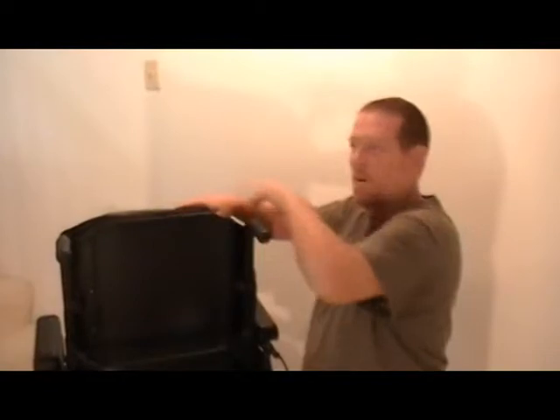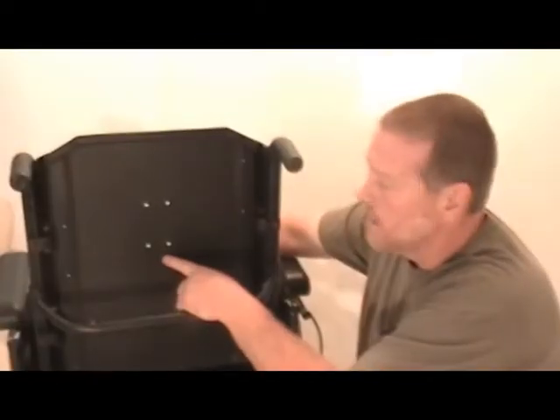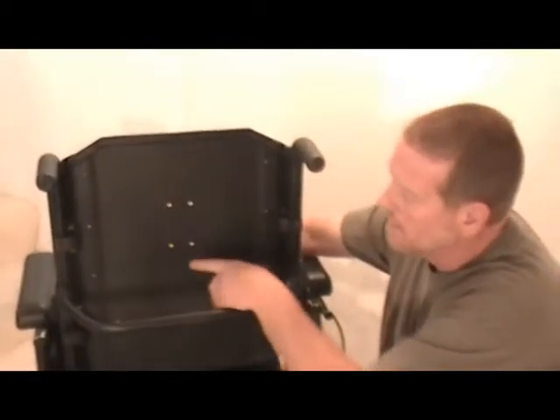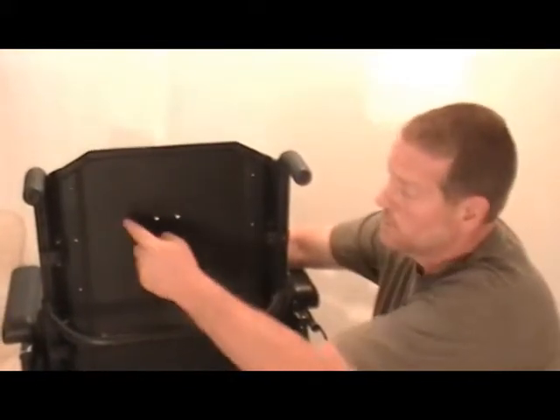Next, we're going to show you how to install the Securiti. First thing you want to do is remove the cover and padding from the back — it's usually just attached with Velcro, just peel that forward. After you have removed the pad from the front, you'll notice this chair has holes already in the back. If your chair doesn't have holes in the back, you'll have to probably drill some holes in it.